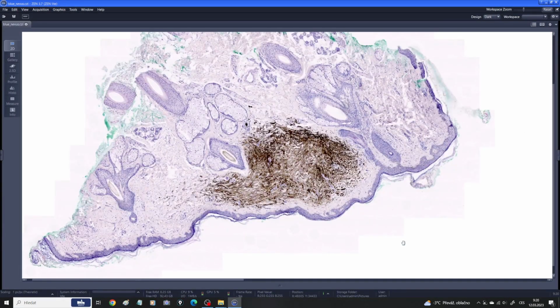So let's leave the compound, intradermal and junctional nevus, and let's discuss something else. Well, I should also mention that it's good to know those subtypes so we can recognize them, but from the clinical point of view, it's not so important, because there is no difference in biological behavior between those three subtypes. And now let's move to another type of nevus, and this is a blue nevus. So let's discuss the blue nevus for a while.